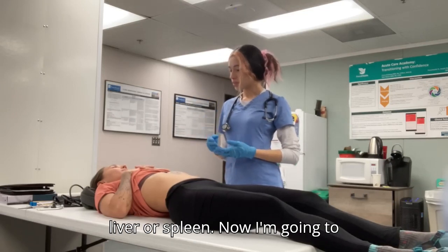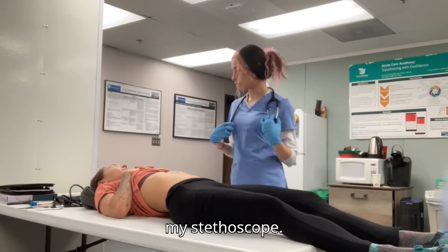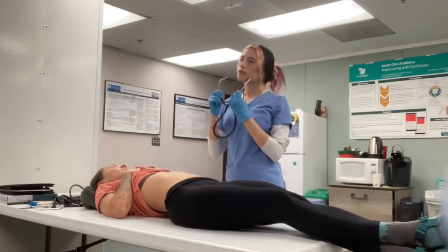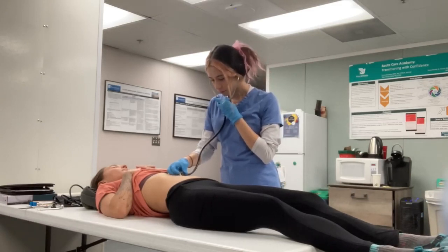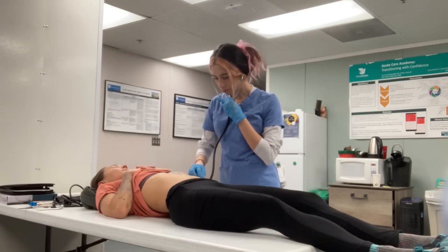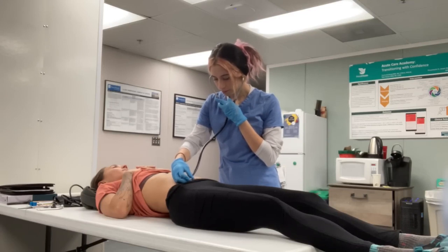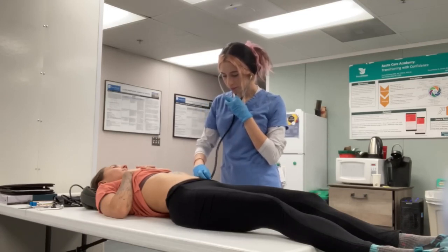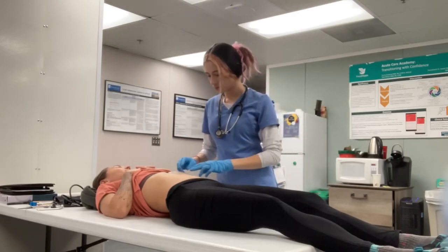Okay, now I'm going to listen to your arteries, your abdominal arteries, with the bell of my stethoscope. So beginning with the aortic. Renal. And iliacs. Okay. Any pain or tenderness there? Okay. Now I'm going to percuss, okay?